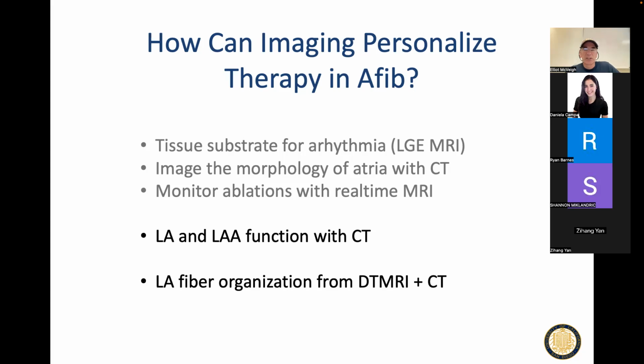And you can see really good left atrial and left atrial appendage function with CT, as we'll see. And I don't know if I have, we wrote about some papers on how the fibers are organized in the left atrium using a diffusion tensor MRI. We had human hearts from donors, and we imaged them for like 4 days each. This is at the NIH. We put the heart in the scanner on like a Friday afternoon, and we came and picked it up on Monday noon, something like that.